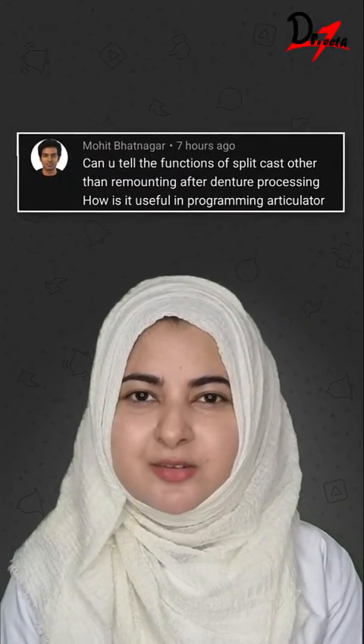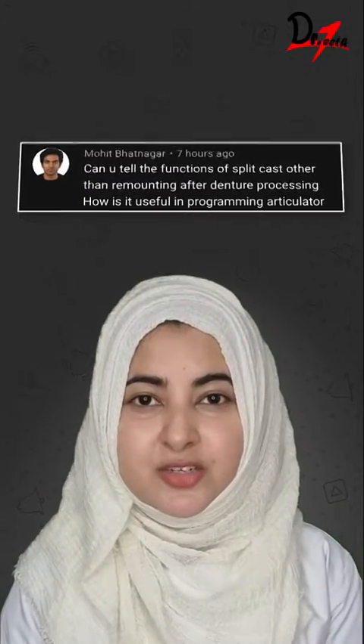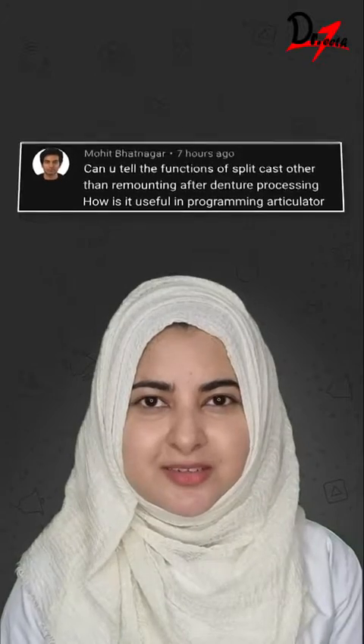In complete dentures, split mounting is useful to verify the centric relation and to program the articulator. Let's see how.